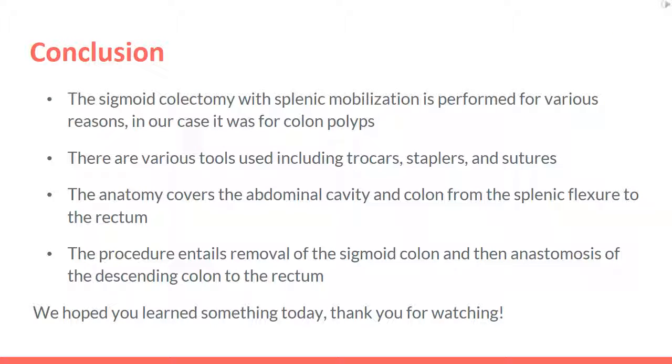As discussed in our agenda, we talked about the indications or why this procedure is performed. In our case, it was performed because the patient had a sigmoid colon polyp. We discussed the various tools used in this operation, including trocars, staplers, and sutures. And we went through an overview of the anatomy and what the procedure entails. We hope you have learned something in this presentation.